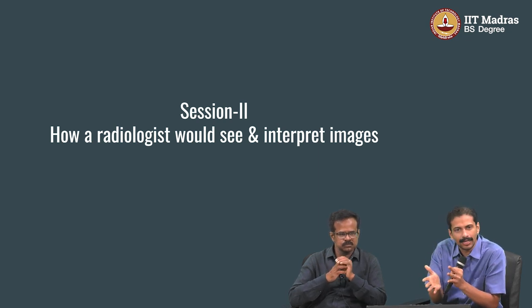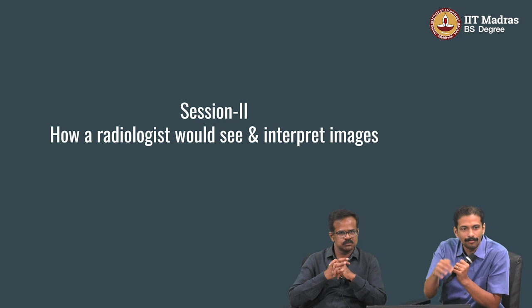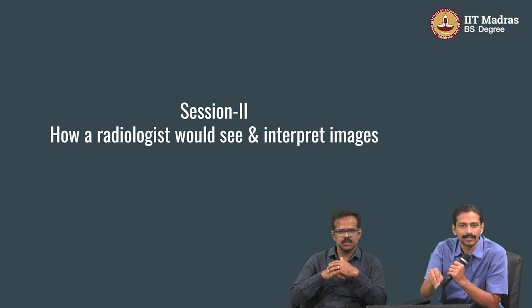Even CT scan is like that. Even ultrasound, I said, is a very good modality without any issues. No, it has some mechanical effects and thermal effects. If you go beyond a particular limit, these are all mechanical waves. They will deposit energy. Good analogy.